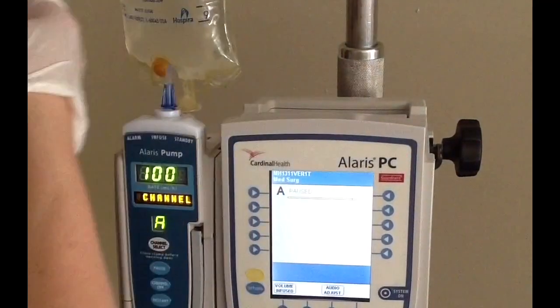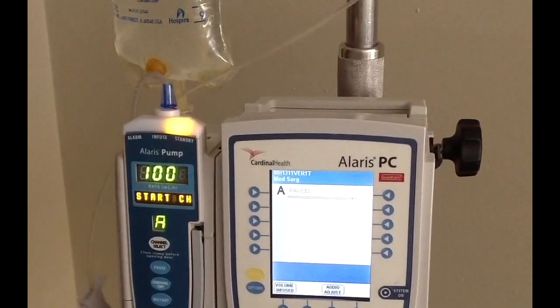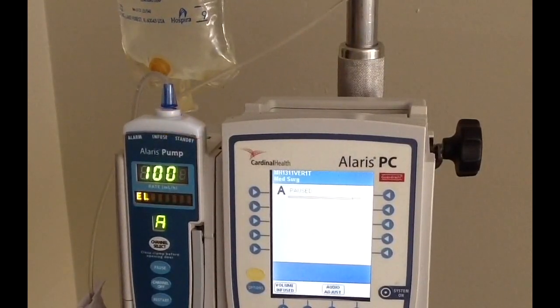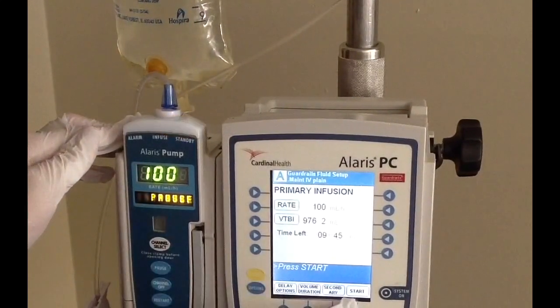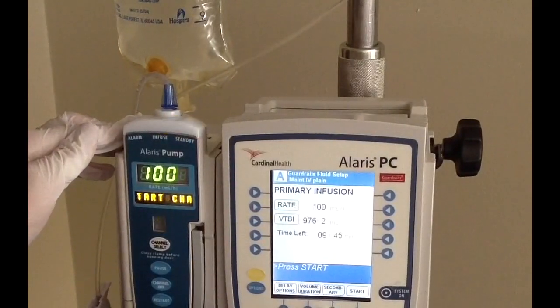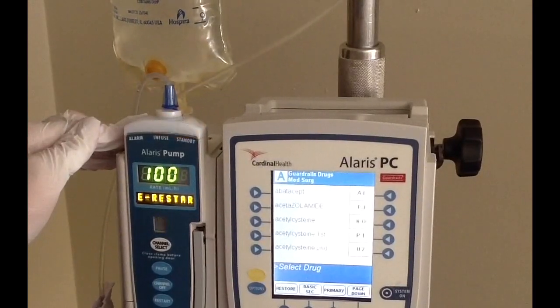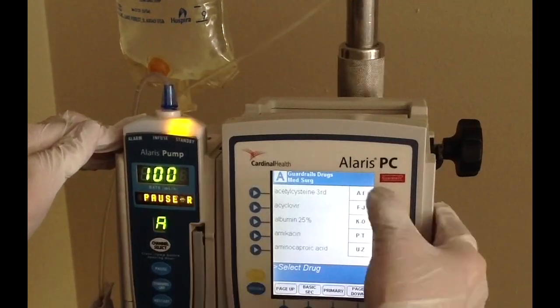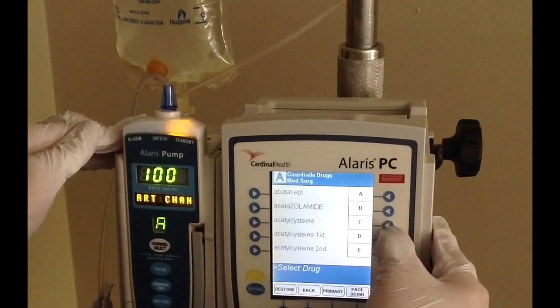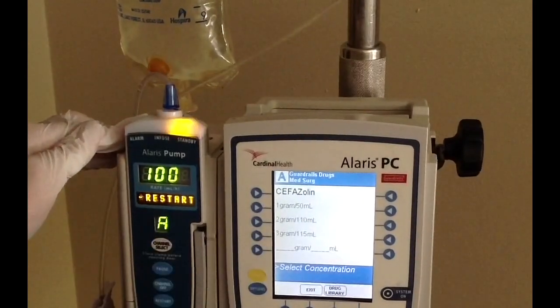Now our pump's been paused at this point, and we can go ahead and move forward with programming our pump. Again, to program your pump, you have to talk to the channel. Press the channel select, and if you note at the very bottom there's a button for secondary. Click secondary, and you're going to choose from the list of drugs here, finding cefazolin. You can use either the page down or use your alphabet on the right hand side, clicking the range and then the actual alphabet letter there, and then choose cefazolin.